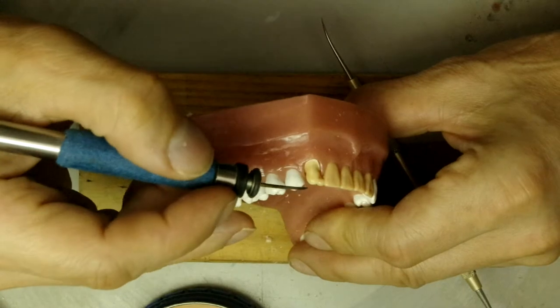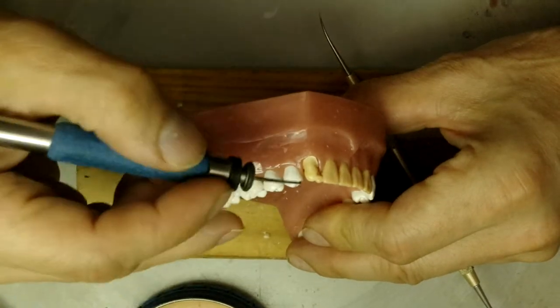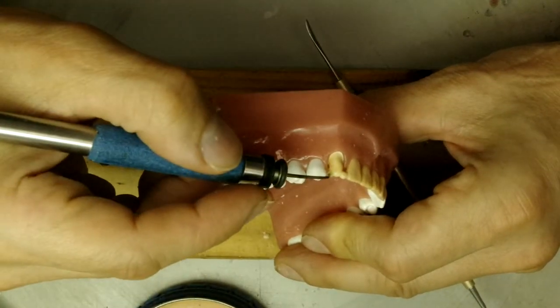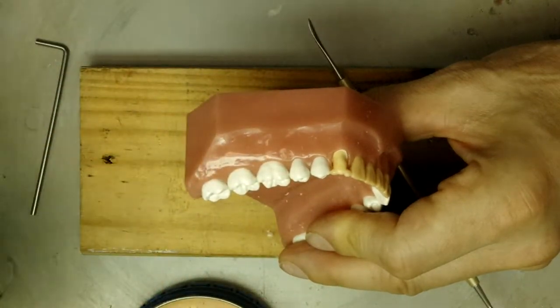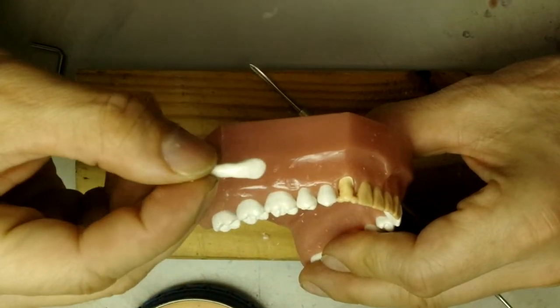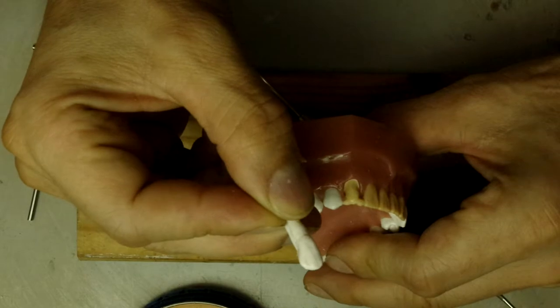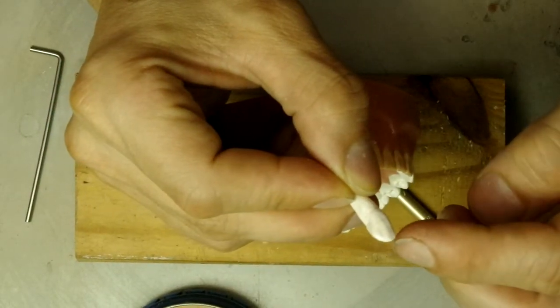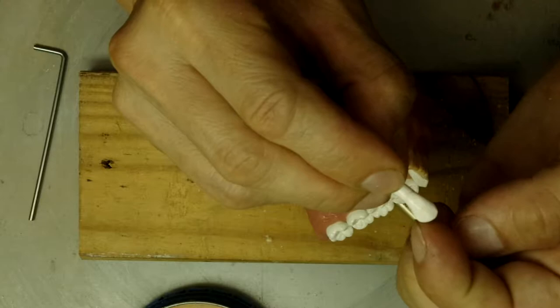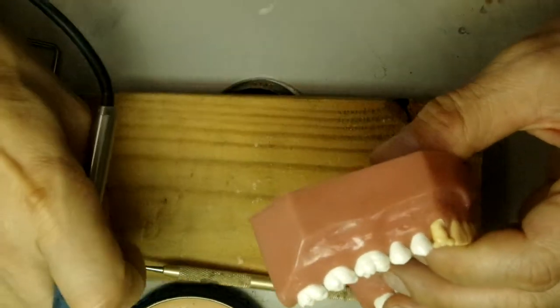Remember your razor blade, so you may have to slice through there. And we do the distal point angle. Also, if we take a look at this tooth, you see on the mesial part, it's a lot shorter than the distal part. So the mesial cusp ridge right there is shorter than the distal cusp ridge there. So that's what we're aiming for on the tooth here.